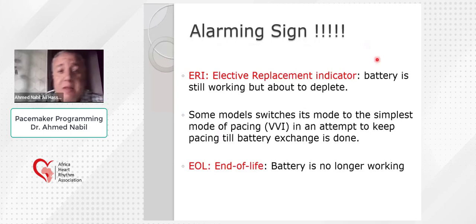We have some alarming signs regarding the battery voltage. The first is the ERI, which stands for elective replacement indicator.